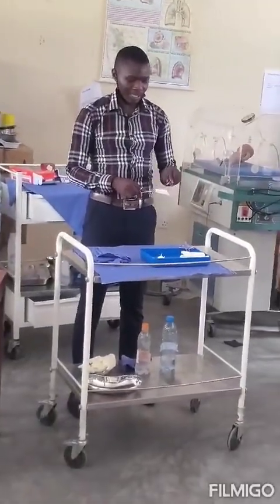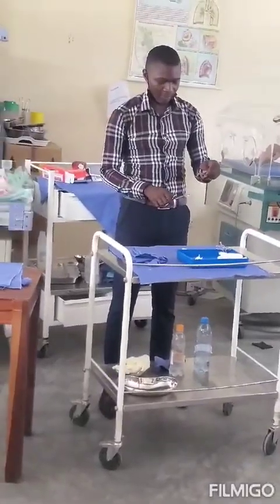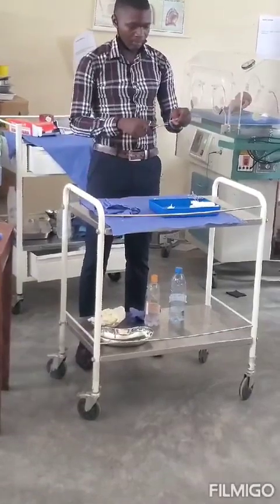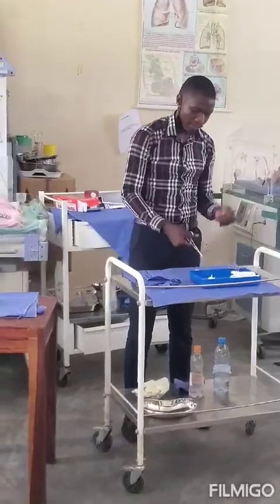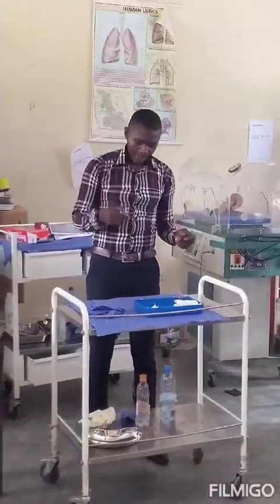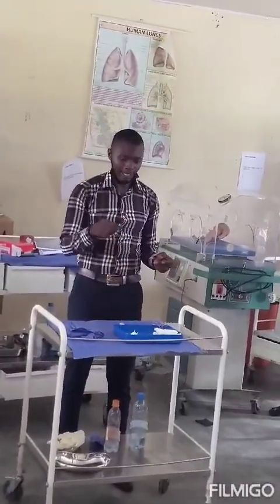Not you hold with the hands. There's nothing like that for us. And clamp the suture properly. Once you clamp it like that, then you can place the suture here or even here, it's fine.